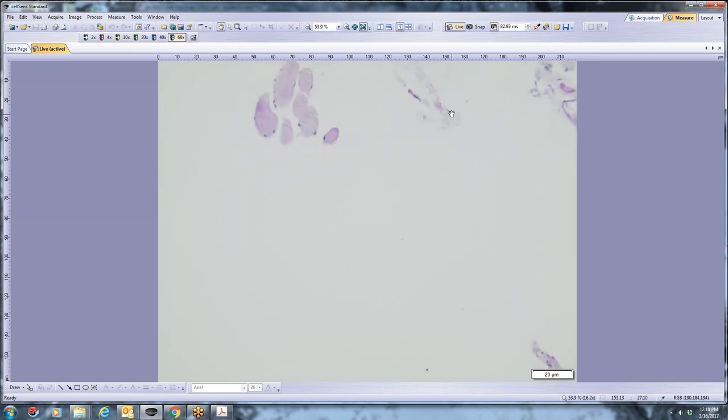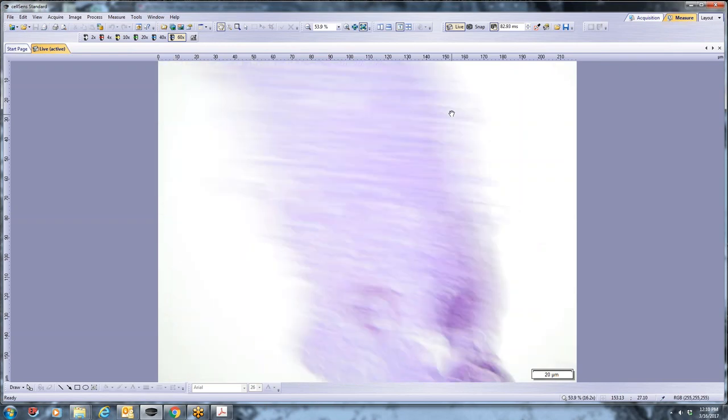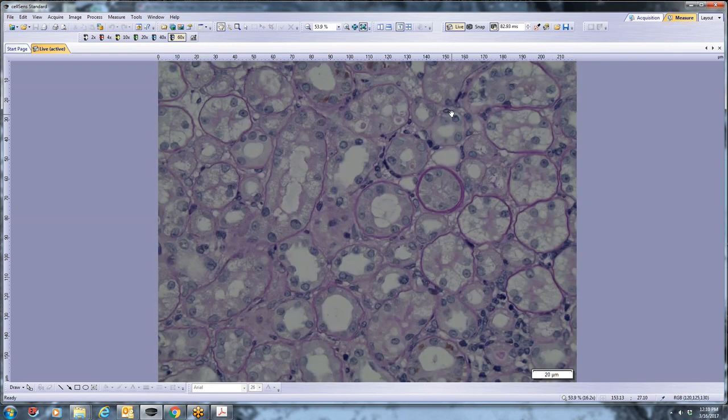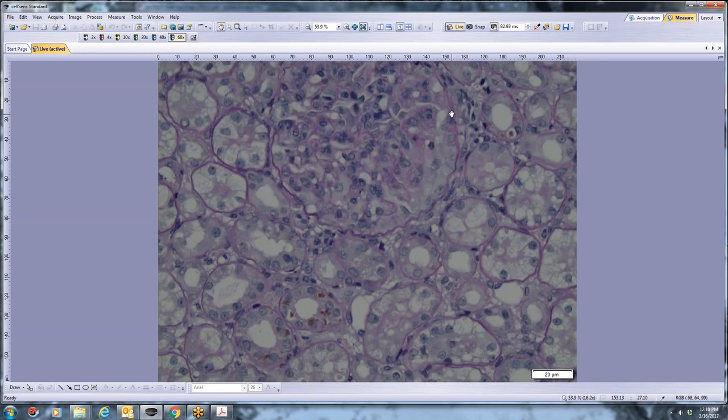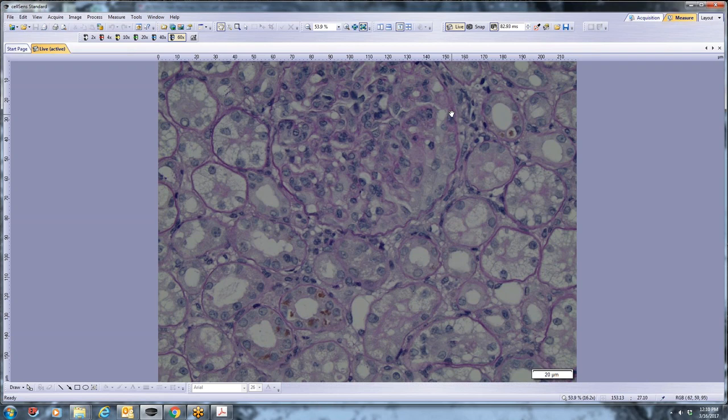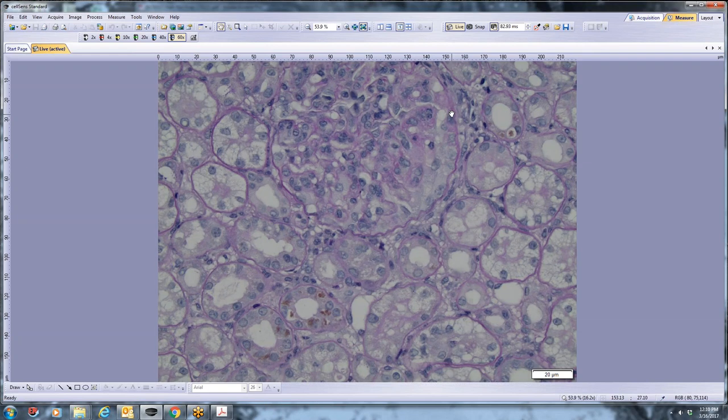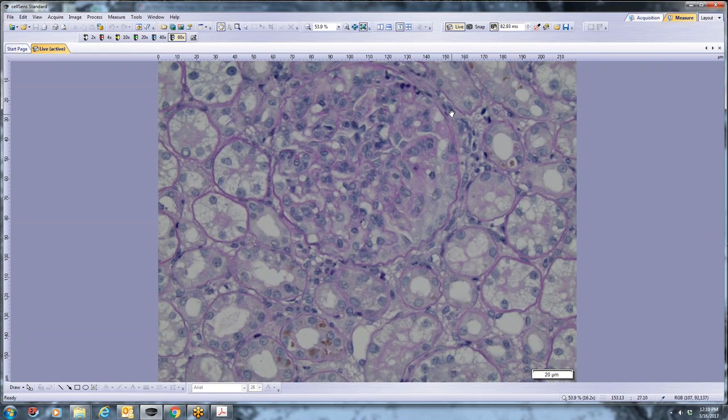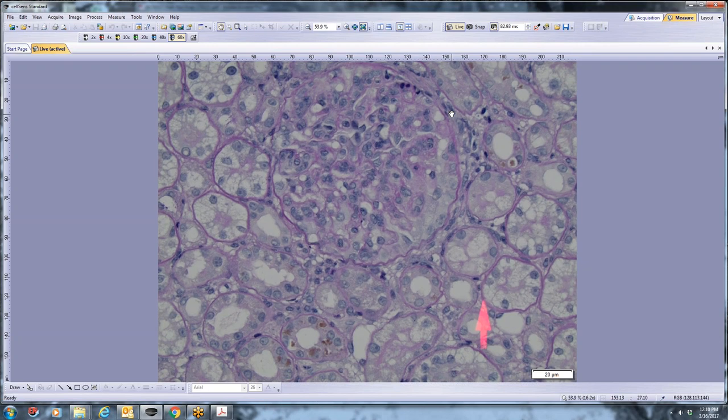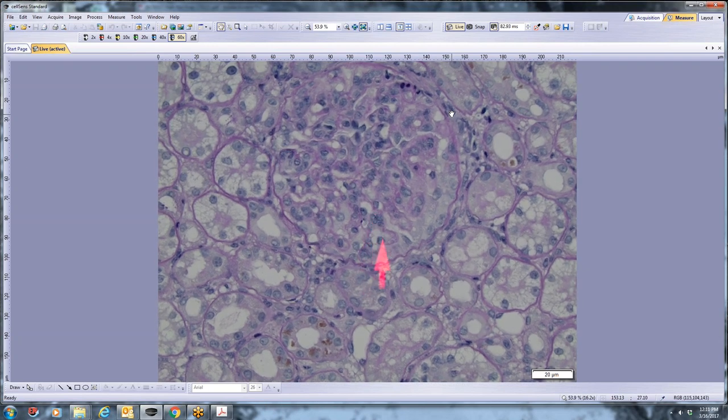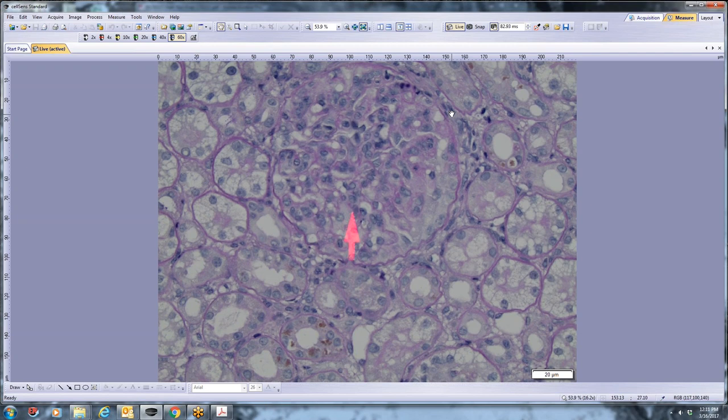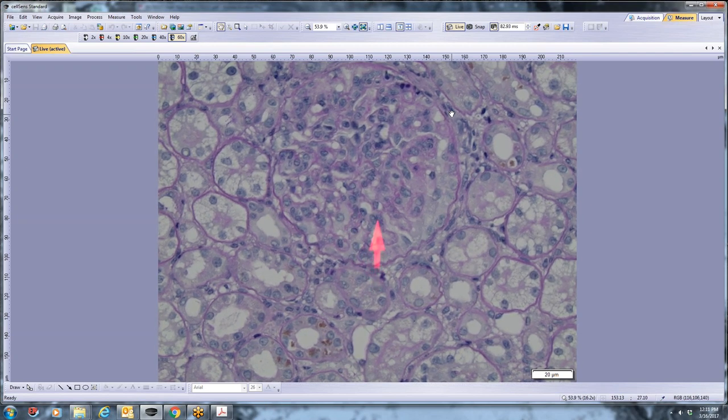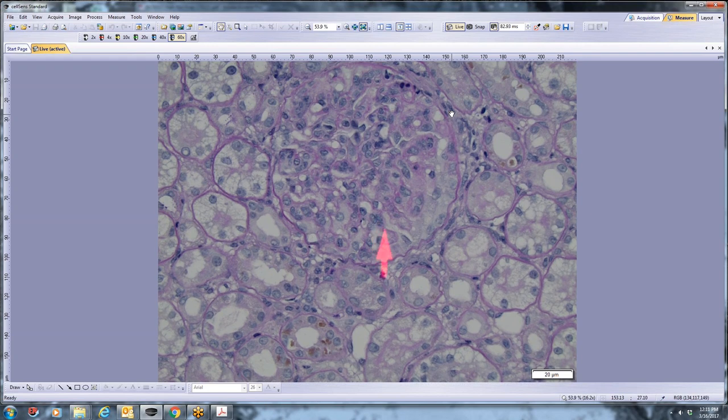So on the PAS, glomeruli are a little bit easier to pick out in this stain. And it's kind of an interesting thing, which is going to tie in a little bit with the electron microscopy. The glomerular tufts have a lot of cells inside capillary lumens.